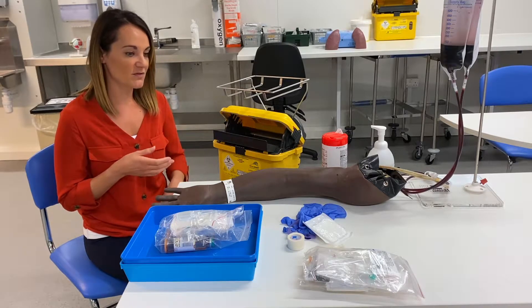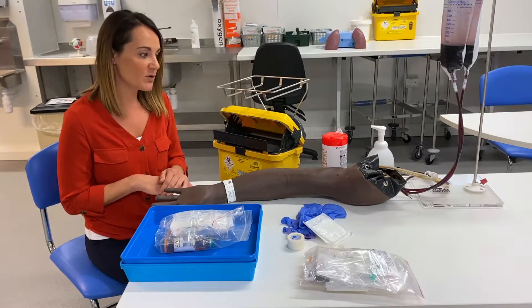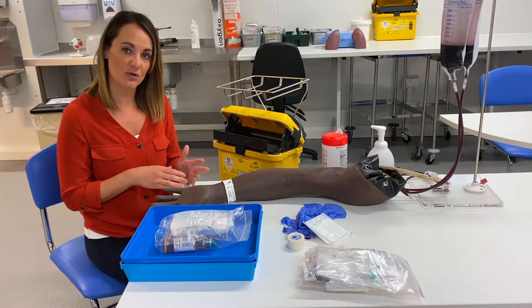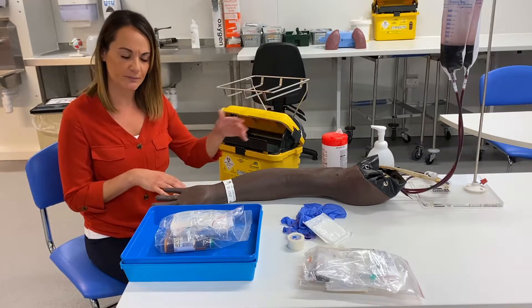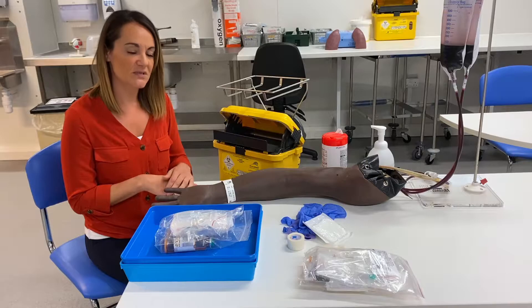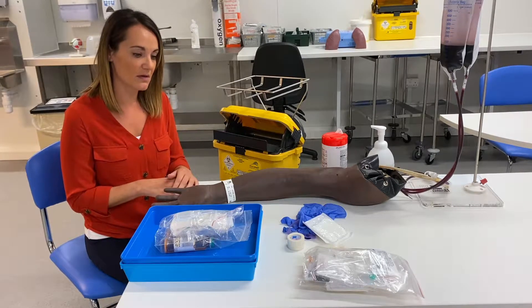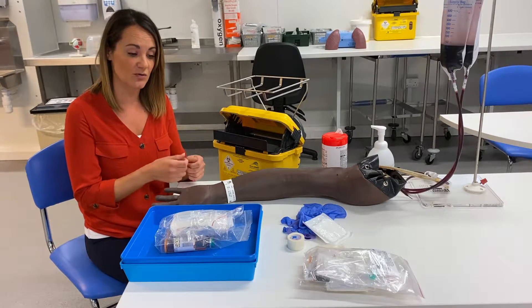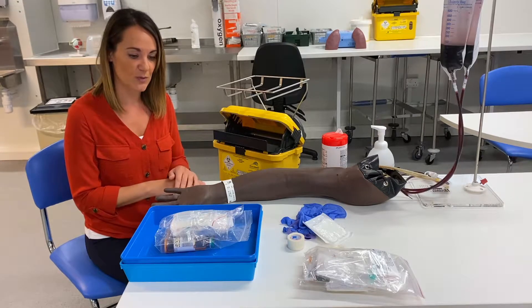Blood cultures can be part of an order set — you might do some cultures followed by normal bloods. If we're going to do that, it's important to remember that blood cultures are done using aseptic non-touch technique, which we've spoken about before. If we're taking U's and E's and FBC, they are just kept in the ward in boxes, so they're not sterile. So if we did those first and then attached our culture bottles, it would mess up our results — so that's important to remember.